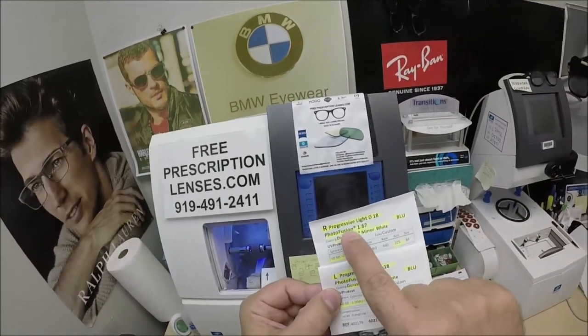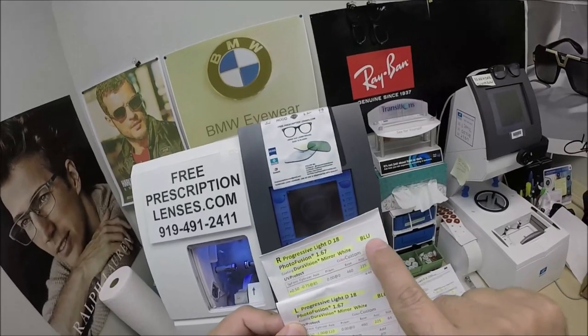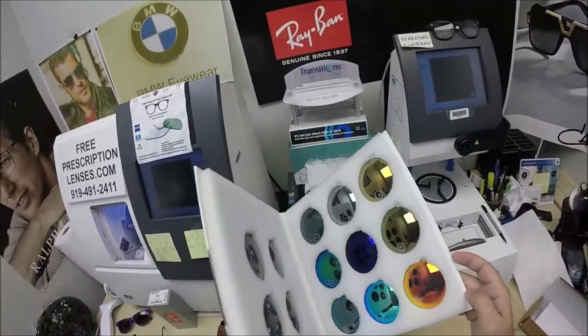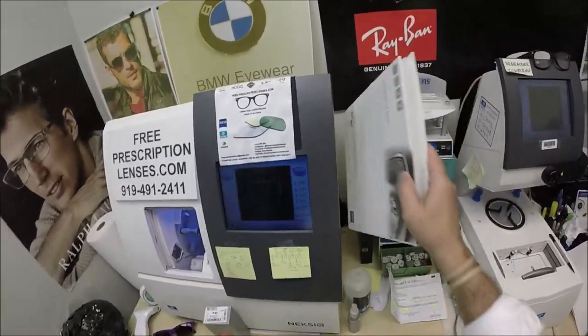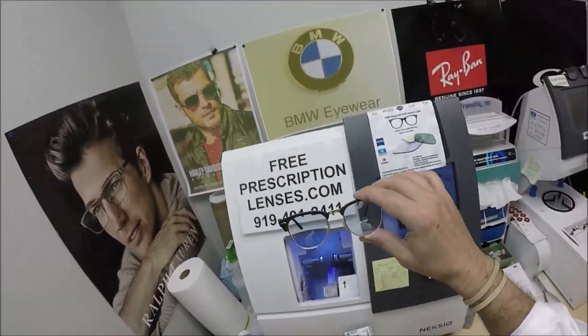You're going to get the original packets from Zeiss, where I've highlighted the Progressive Light D, 18 Photofusion, 167 High Index Blue, DuraVision Mirror White. To avoid the confusion, they have flash mirrors and silver mirrors — they already have a silver, so that's why they call the flash mirror white. And that's why I still call it silver-white, because you'll see that it'll turn that.